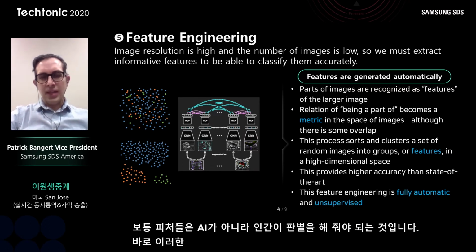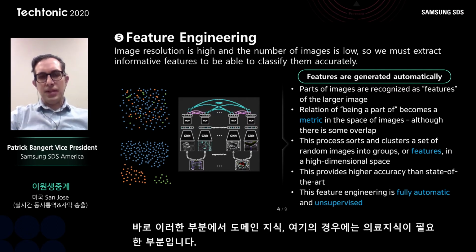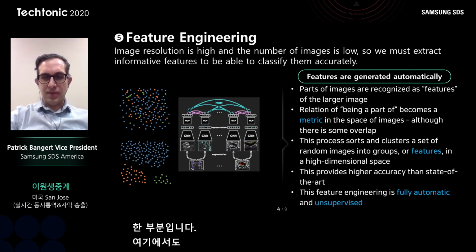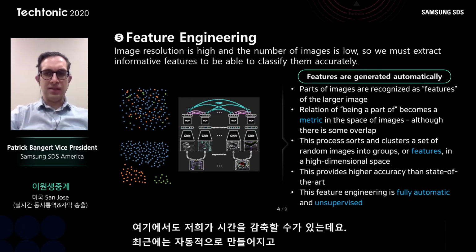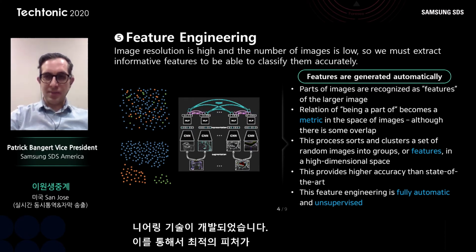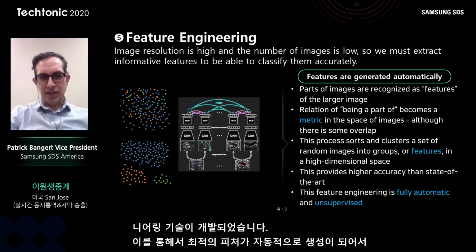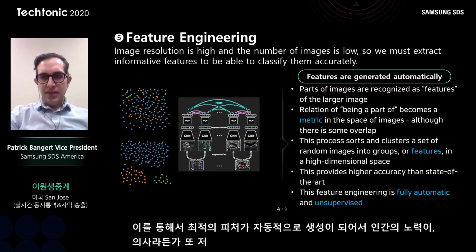artificial intelligence. However, we can save ourselves that work as well because in recent years, methods have been developed to automatically generate and select the right features for image data sets as well as for other kinds of data sets to arrive at the optimal feature set. And this engineering is done fully automatically without requiring human participation, neither domain experts like doctors, nor the participation of data scientists like myself.